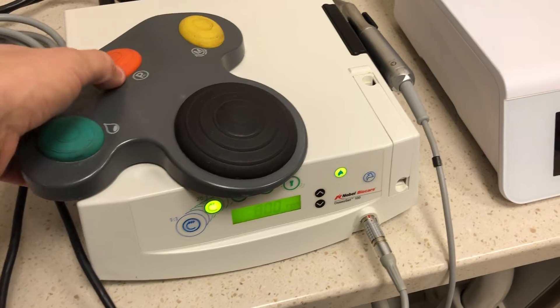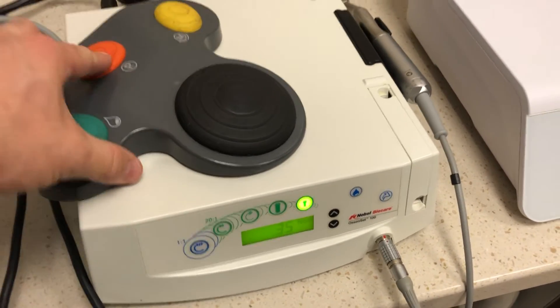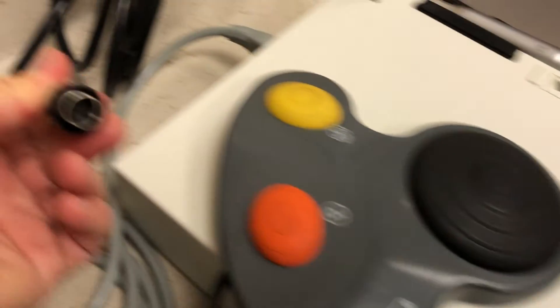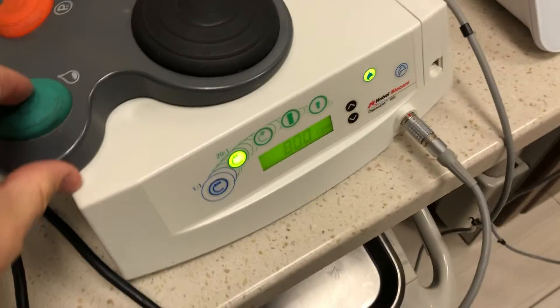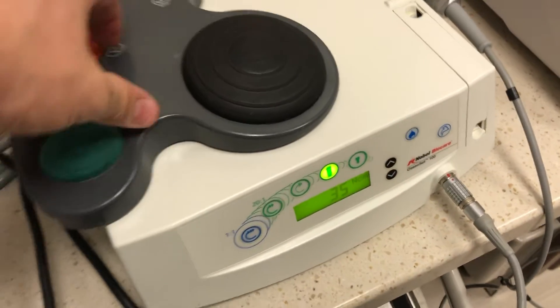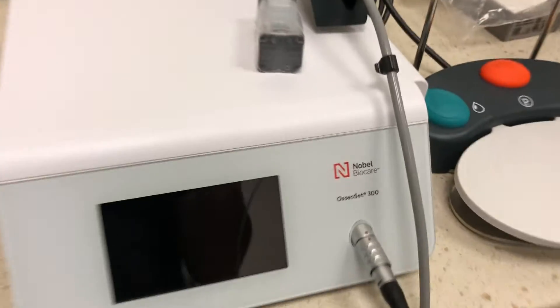This simple device has basically been used thousands of times and functioned very well. Aside from a few glitches with the pedal — sometimes not doing reverse, sometimes not doing the water on and off — it has served me very well for over a decade. The plug is one of these DIN type sockets. But it works very well. Fast forward to a more recent model: the Osseoset 300.